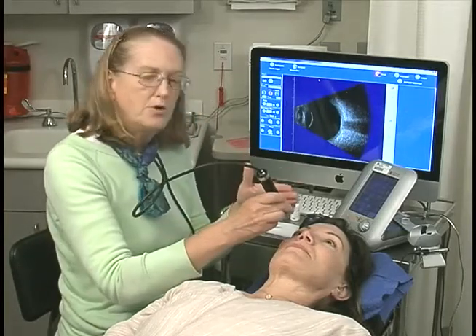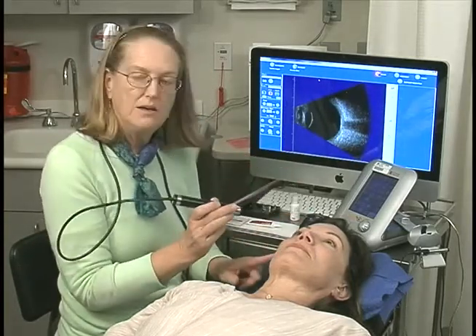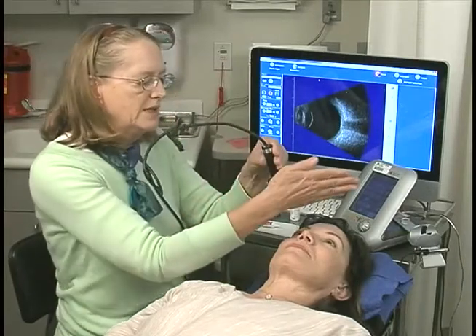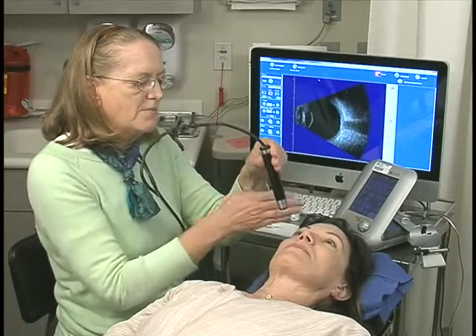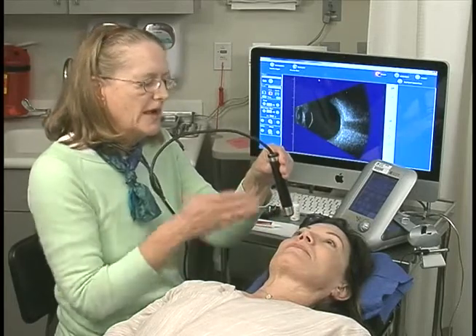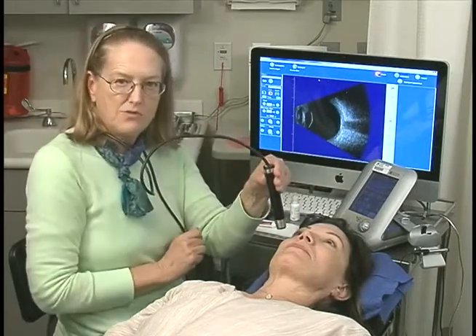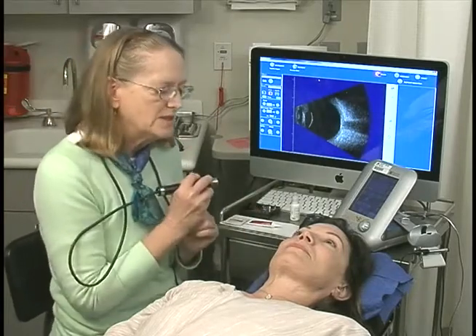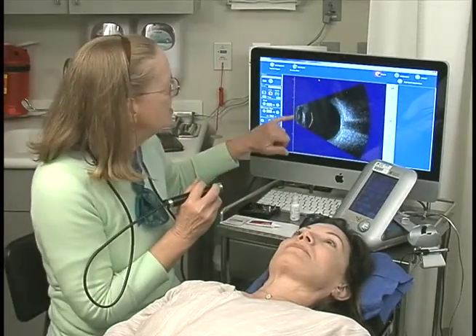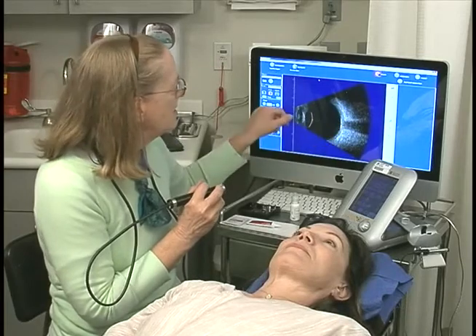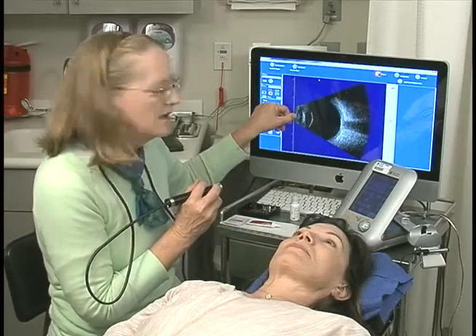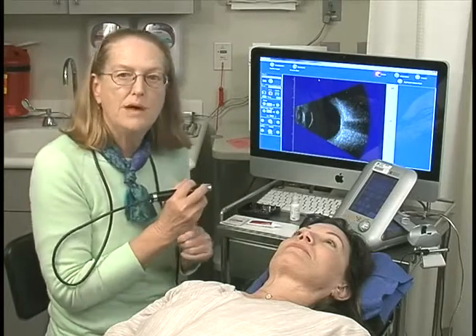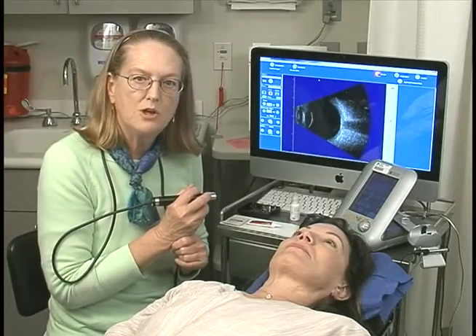You may need to do an oblique scan — if the patient had an inferotemporal melanoma, for example, then I would do an oblique scan so that I would have both the tumor, the lens, and the optic nerve all in the same view. And on the horizontal scan that we just did, that could also be used to take a measurement of the axial length. When I have enough distance and I can clearly see the anterior cornea, I'm confident about double-checking the measurement of a staphyloma eye.